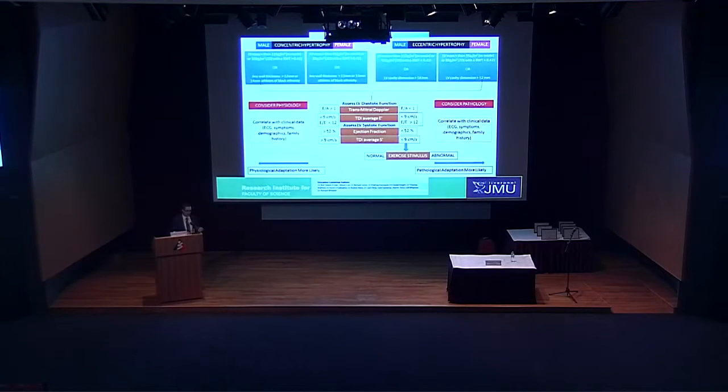We've added something different in here, and this is new to these reviewed guidelines. And this is the concept of an exercise stimulus. I'll present a case in due course which highlights the importance of that. If these athletes present with hypertrophy and then they have abnormal function, you have to consider pathology. But this is a key box here. You've got to correlate it with clinical data, with ECG data. It doesn't stand on its own right. You've got to think about other investigations and think about family history.